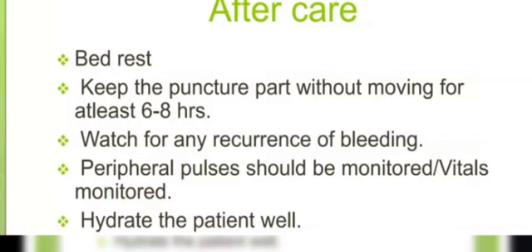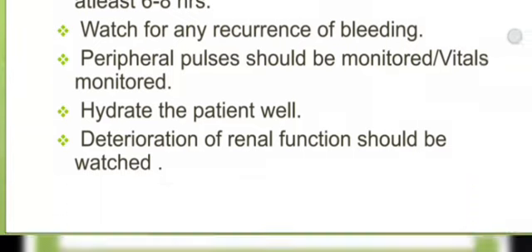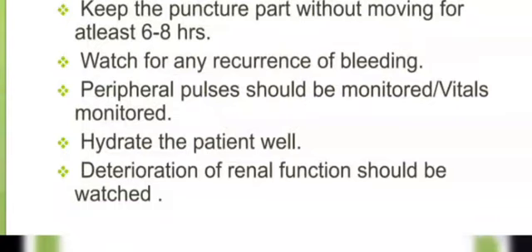Bed rest is compulsory, and you have to keep the puncture site without moving for at least 6 to 8 hours. You should watch for any recurrence of bleeding. Peripheral pulses should be monitored. Vitals should be monitored continuously, the patient should be hydrated, deterioration of renal function should be watched, and the patient should be taken care of properly.